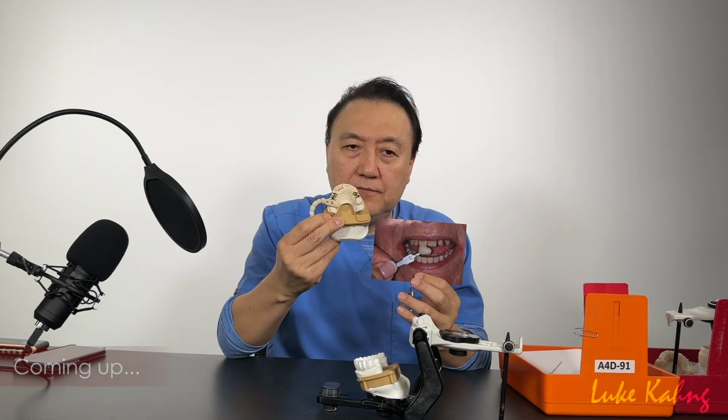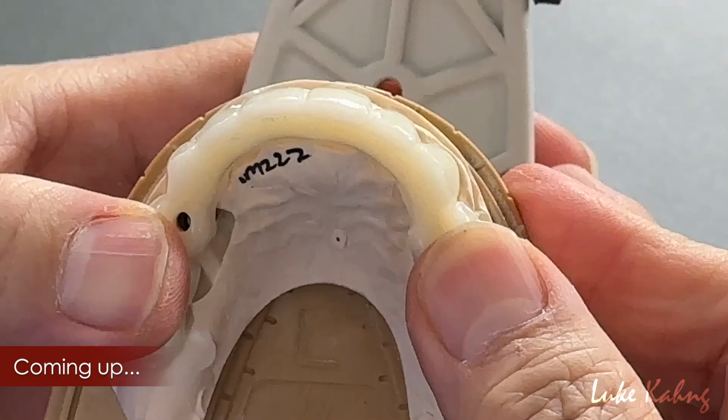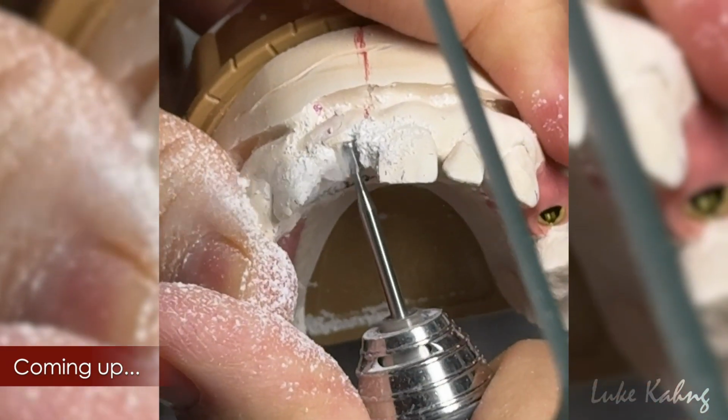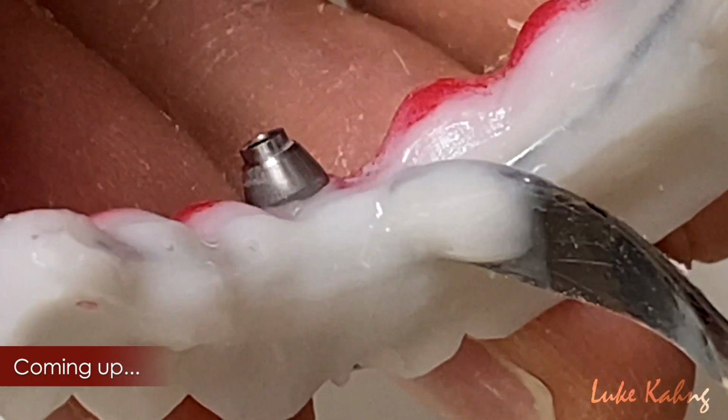In order to make the full mouth restorations, temporaries are very imperative for the patient. If I want to do the full mouth restorations, I will do it like this. I'm going to give you some more information and also a tip for you.